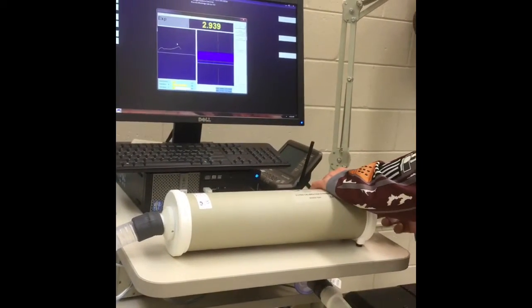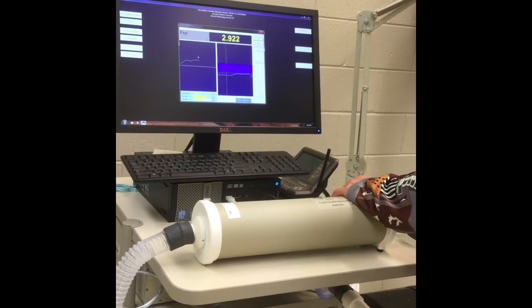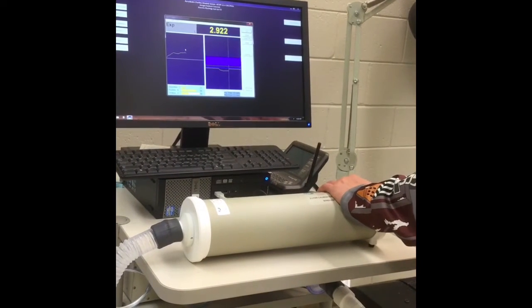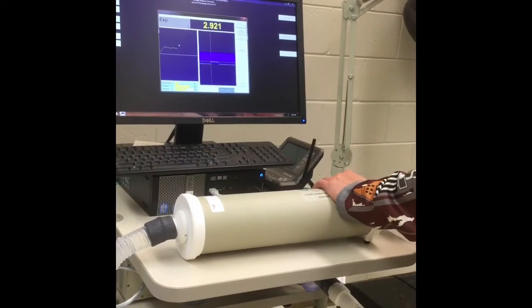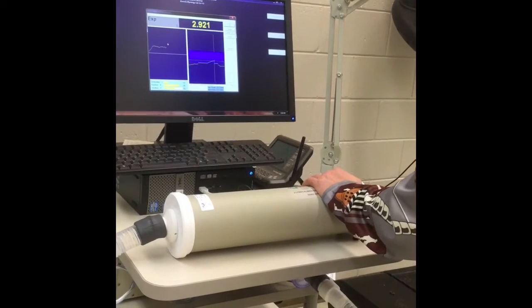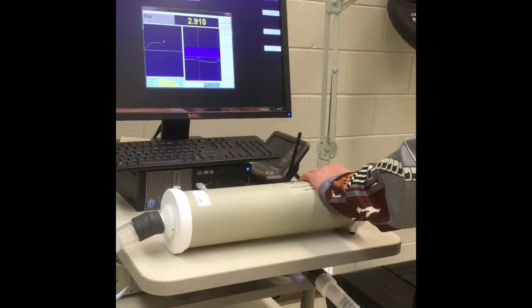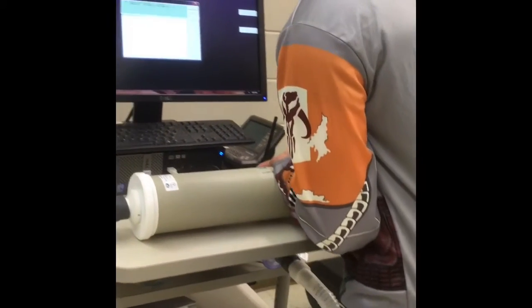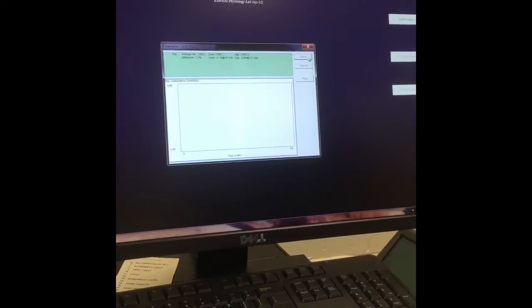The next stroke will be 100 to 200 milliliters, followed by 200 to 300 milliliters, then 300 to 400 milliliters, and finally the last stroke at 400 to 500 milliliters. We are right at the 2% error threshold, so this is a valid calibration. Click save.